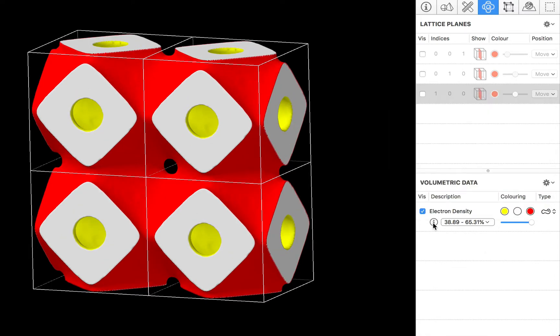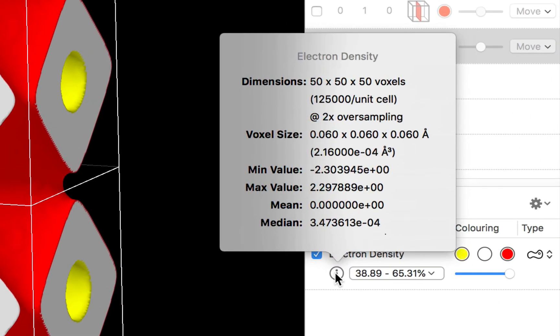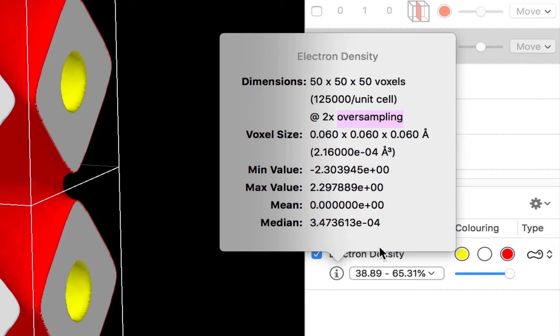Finally I should note that there is a little info button here which we can click and that displays you a bit of information about the number of data points in the structure. Whether or not we are using interpolation, that's this oversampling value here and the range of data values.